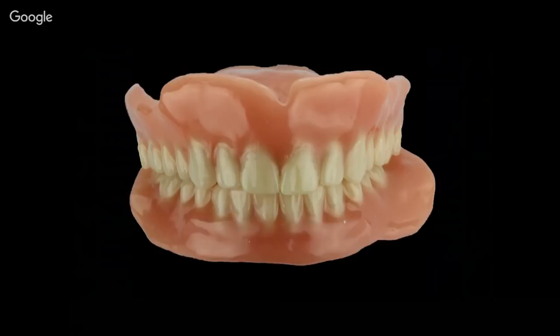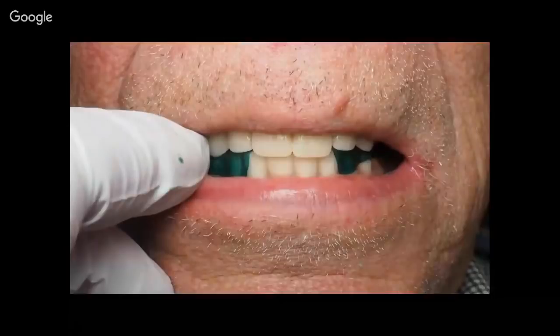It's going to drop into all of those little cracks, and then you hit it with a light curing unit and it will smooth this thing out. You can make a glassy smooth appearance to the acrylic here.